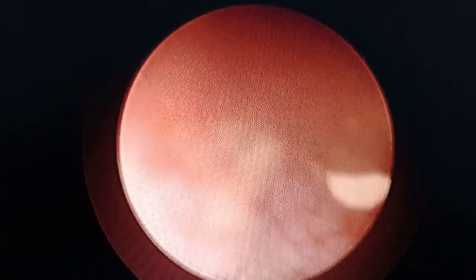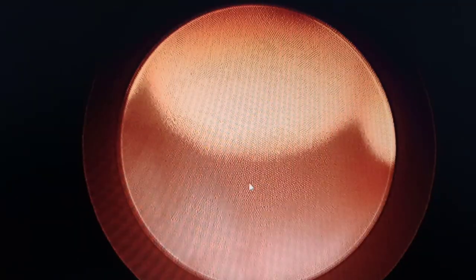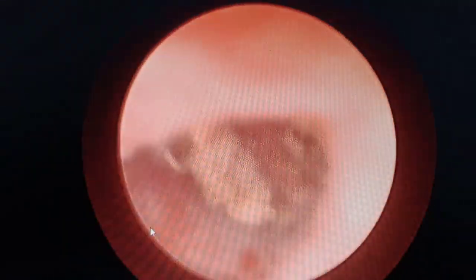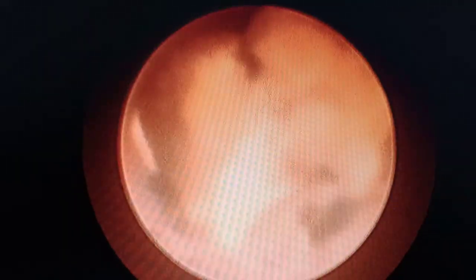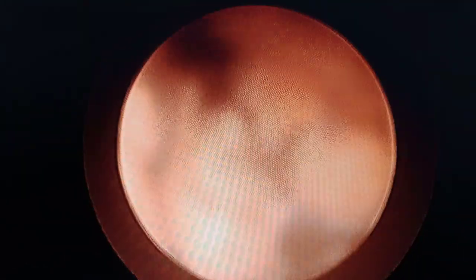Although the vision is not as clear as during cystourethroscopy, now here you can appreciate the ureteric wall below, and this one is the stone. We have now been successful in entering the ureteric orifice — the left ureter. The next step would be to slightly push this fragment upwards so that we can enter inside and use the pneumatic lithotriptor to break the bigger stone into smaller fragments.